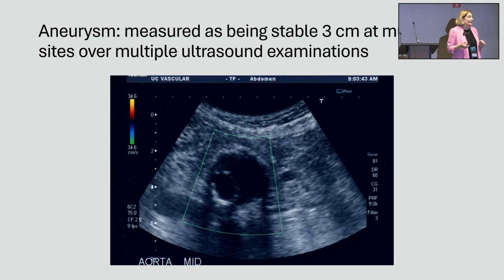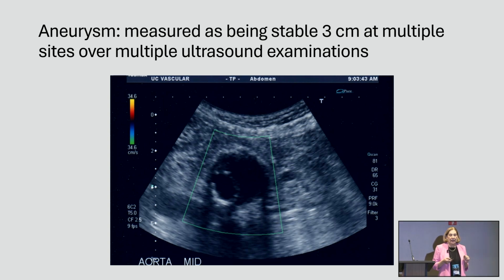This is one that we didn't make, and this was not my catch initially. It was my wonderful colleague, Mary, we don't work together anymore, and she was working on a machine, and this patient had gone from lab to lab to lab in different parts of the country as he was moving across country to settle with a son somewhere. So, 3 centimeter aneurysm, stable, never changed. Always been 3, it stays at 3.